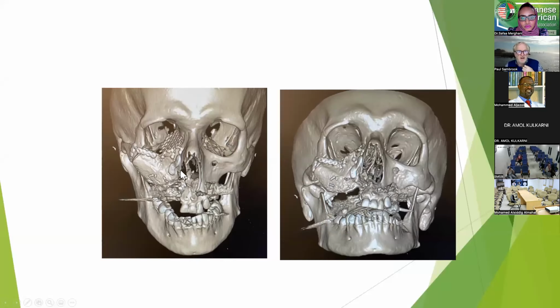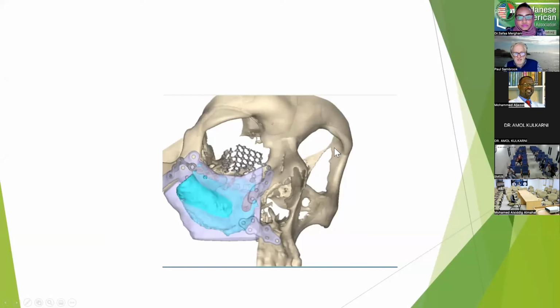And again, looking at functional reconstruction, we need to be able to follow these patients, but we also need to look at functional reconstruction for these sorts of people, so that we have a mixture of bone, soft tissue, and mesh here for reconstruction of that orbit, orbital floor, to ensure that this patient has the most optimal reconstruction of their masticatory apparatus.